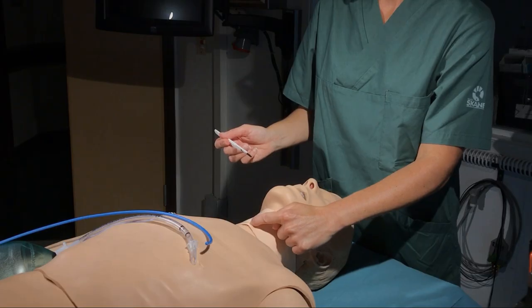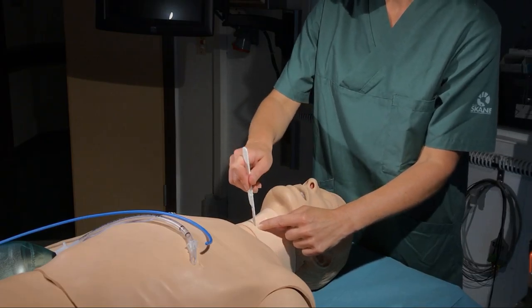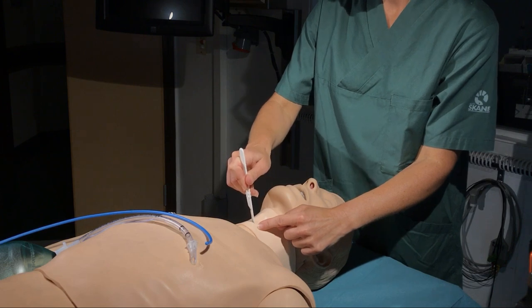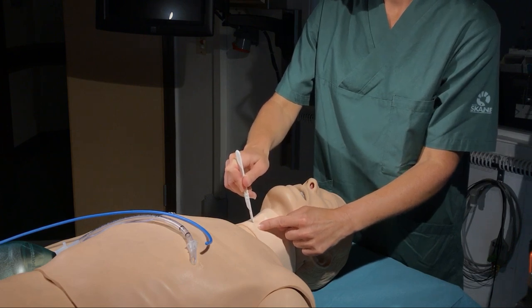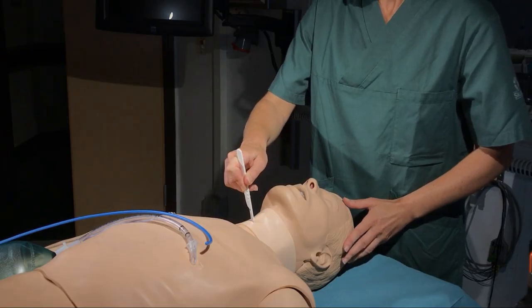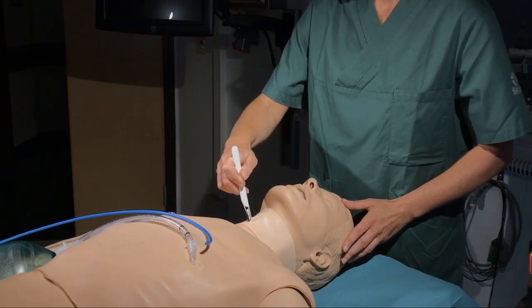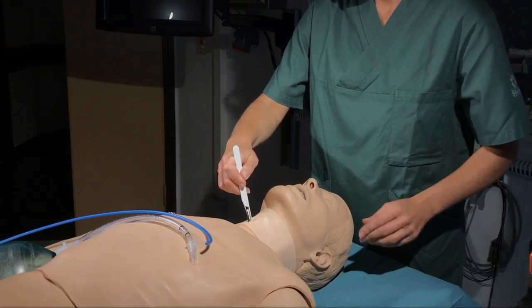When you're confident about the anatomical landmarks, make a stab incision in the cricothyroid membrane. Do this vertically, so you have the wide, broad cartilage part of the cricoid behind the tip of the blade. Then turn the blade sideways so the sharp edge points caudally. Pull the scalpel towards you to open up the incision.